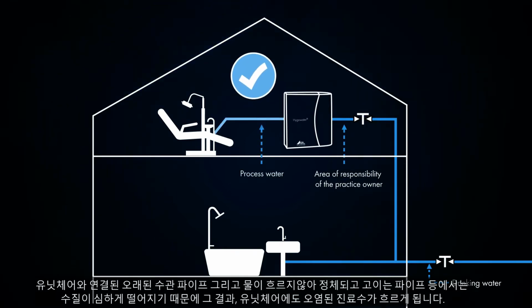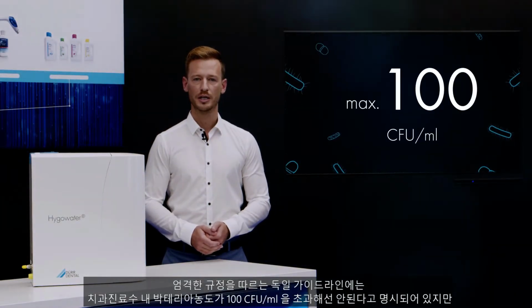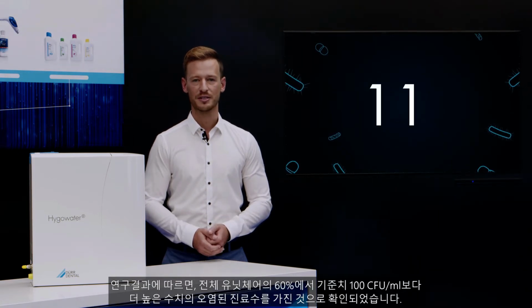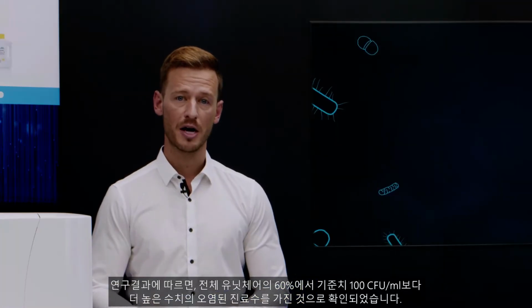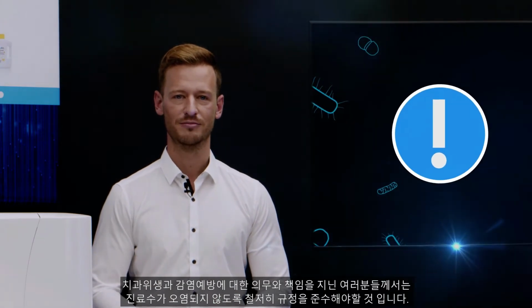On top of that, the dental unit itself is also potentially a source of risk. In Germany, a level of 100 CFU per milliliter must not be exceeded. Unfortunately, studies have shown that around 60% of units in use exceed this value. As the operator of a dental practice, you have a duty to ensure that the water used in the practice does not represent a potential hazard.